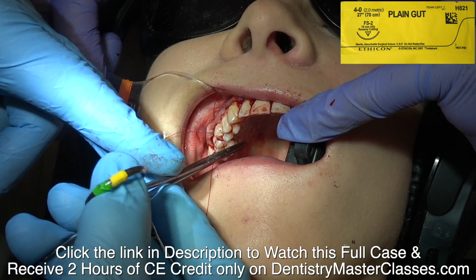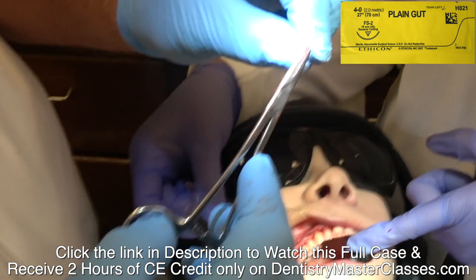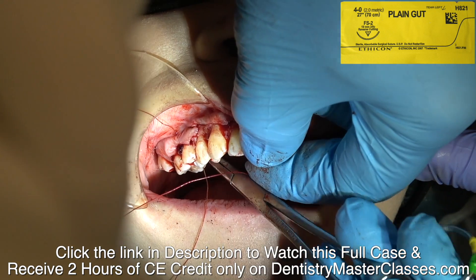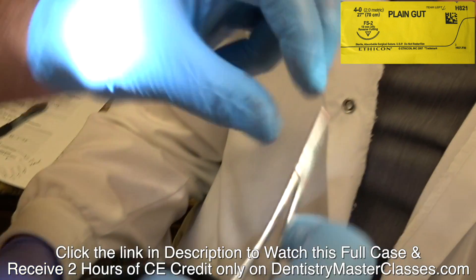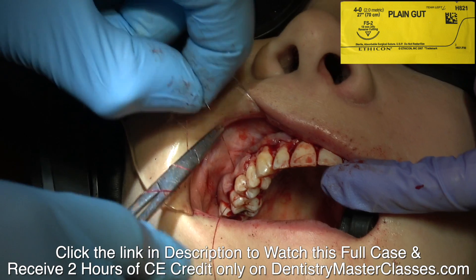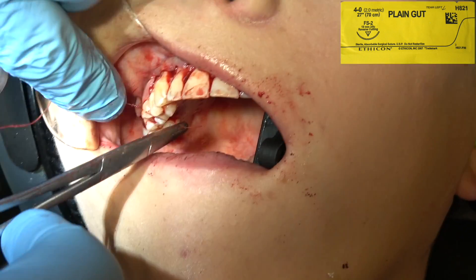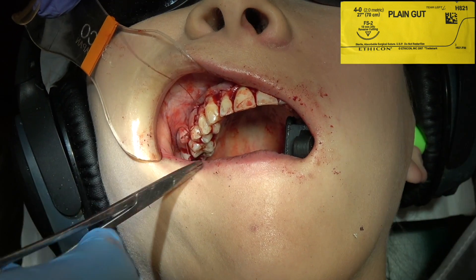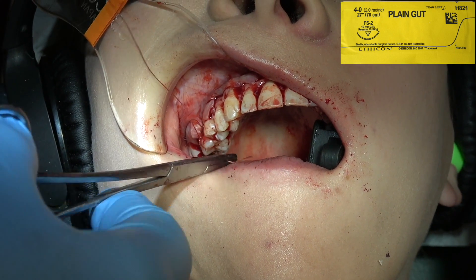You can see I'm not engaging that tissue on the palate when I move the needle from the facial to the palatal. Now I'm engaging the palatal tissue. I'd like to do three wraps, then one wrap toward me, then one wrap away. Sometimes I just use two, but it's better if you can do three wraps away, one wrap toward you, and then one wrap away. It's very important that you've anesthetized the nasopalatine and the greater palatine nerves.